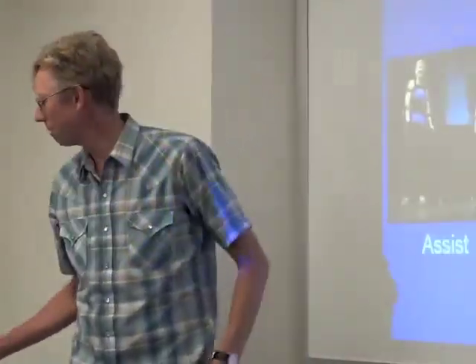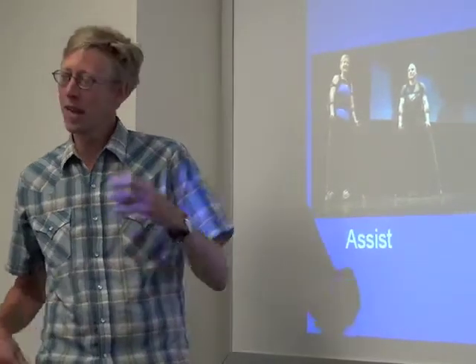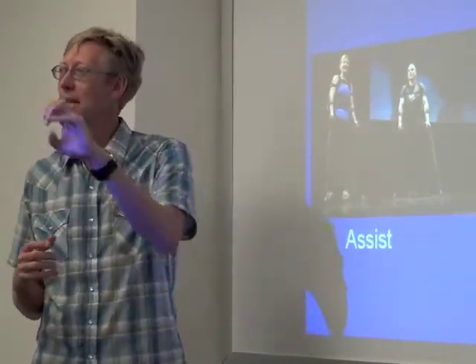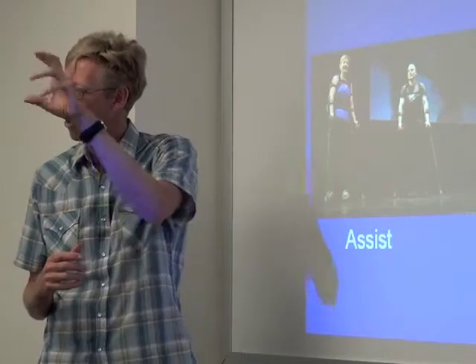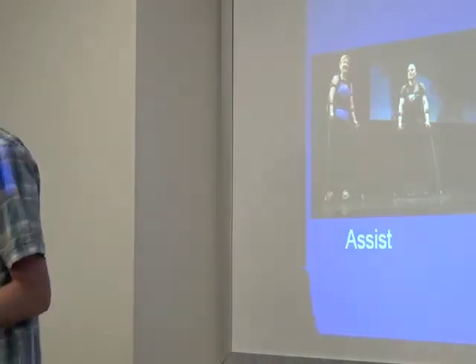And then for replacing, there was a real breakthrough in prosthetics recently. Actually, there's been a couple, but did you guys see Oscar Pistorius at the Olympics, the guy running there? That was pretty cool to see. This is work by Todd Kuiken at Northwestern University, and there's a holy grail in upper extremity prosthetics, which was how could you give someone control of multiple fingers, like in Star Wars, like Luke's arm, right? How do you get that?